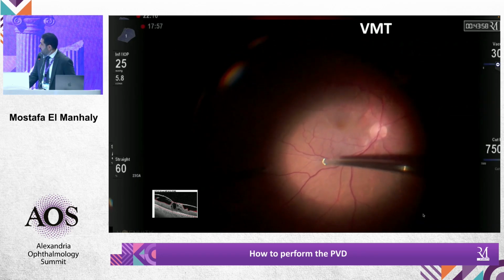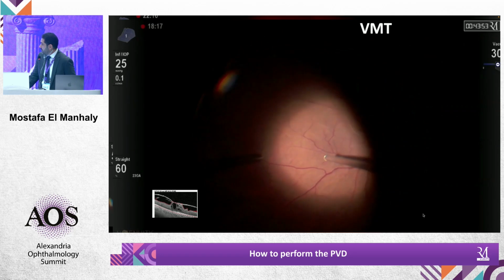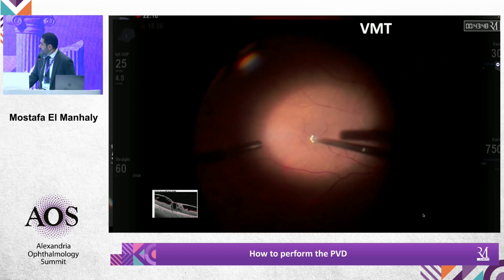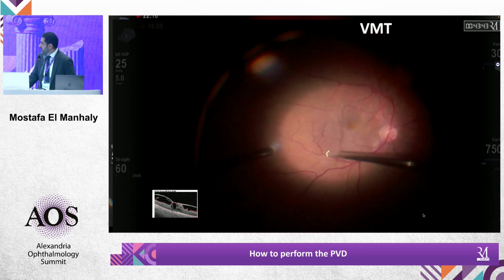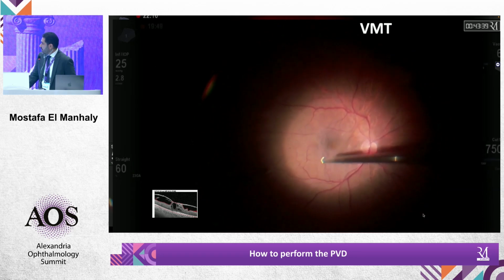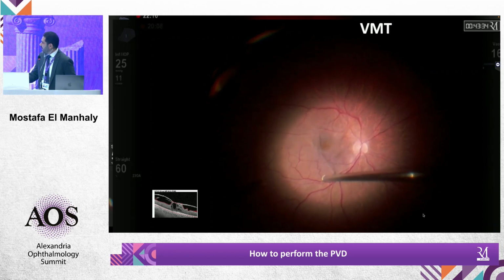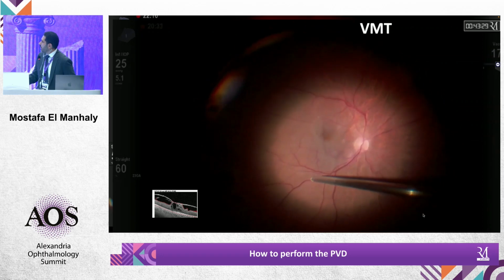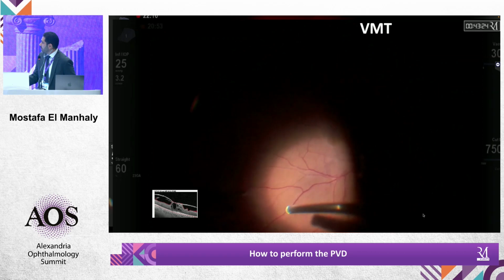Well, you just showed it. You go circumcising. In these patients, I put triamcinolone. This is very important to see the dynamics of the hyaloid while you're cutting all around. I always leave a stump coming out with the least traction on that stump till the end. I like to see what I'm doing, especially in the macular area, then circumcise all around to have a stump of vitreous coming out till it detaches. So we are trying to separate the premacular vitreous from the whole vitreous, and then we will deal with this area. Exactly. I don't do a PVD then. If you do a PVD, you have a high risk of creating a break. Of course, judging by the preoperative OCT gives you a clue. If there is epiretinal membrane, you have a higher risk than if there is no epiretinal membrane.